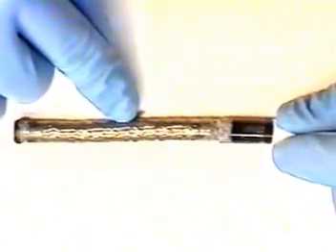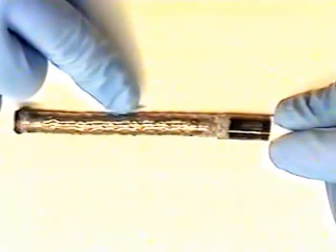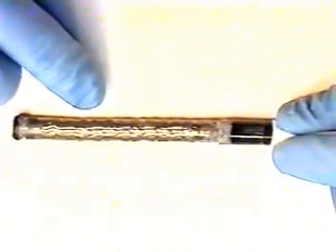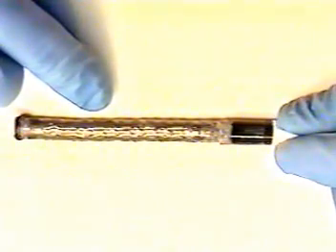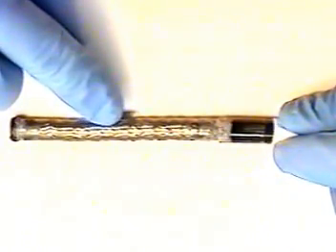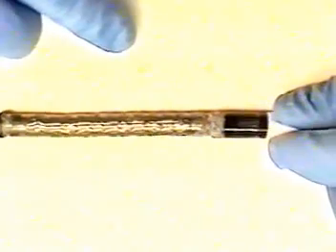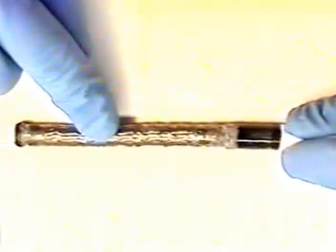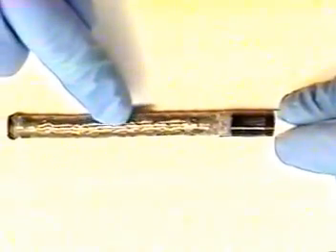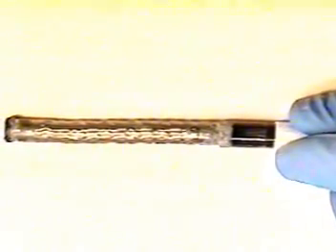If there is moisture inside the endoscope, it has either a minor or major fluid invasion, which in turn means the instrument will need to be aerated in a vacuum oven chamber. If you do not have access to a vacuum oven chamber, it will have to be repaired at a repair facility. Since your endoscope is dry and there's absolutely no fluid in the bending section mesh, we can proceed with replacing the bending rubber sheath.